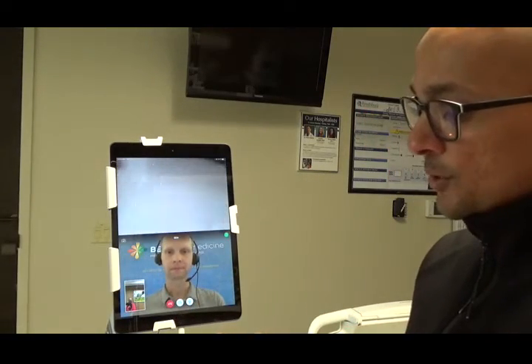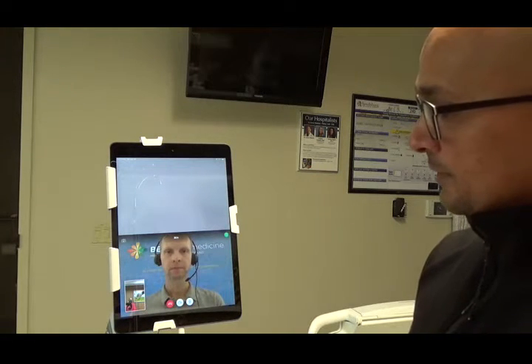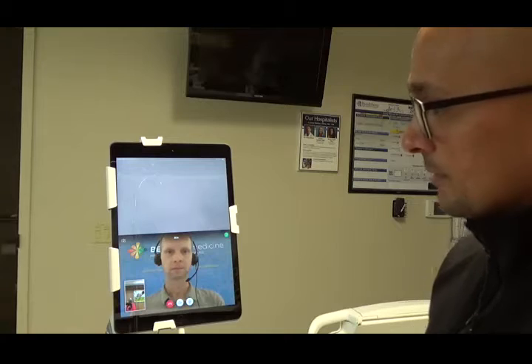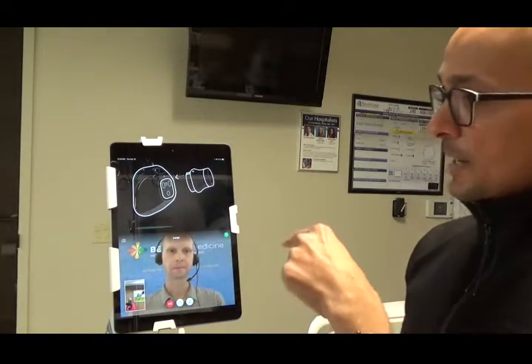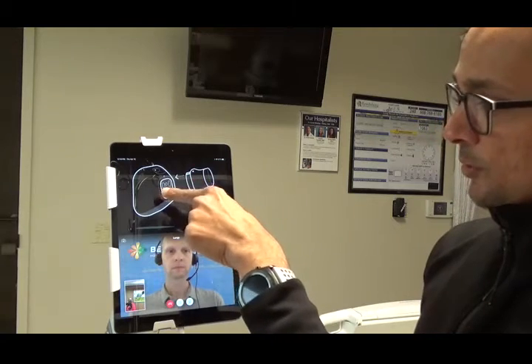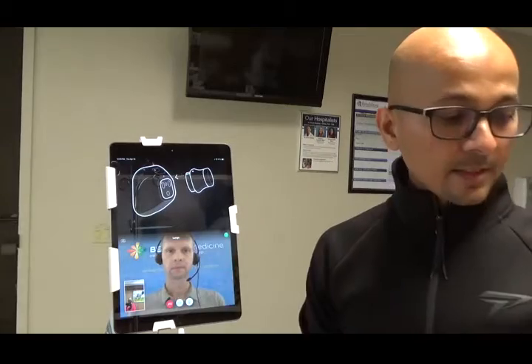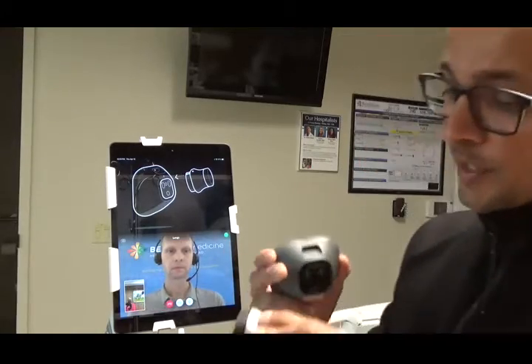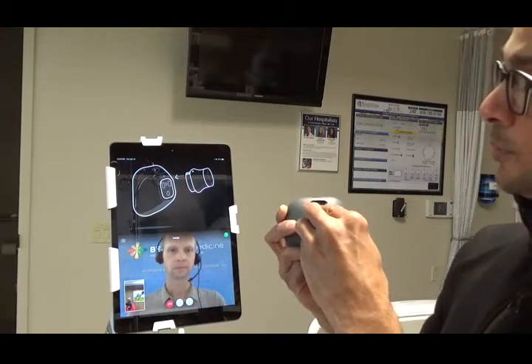So now what we could do is move forward to the auscultation part. Do lungs next. So we're going to do lungs, and it's really intuitive. It's going to tell you what to do, right? Which is saying this is a device, and this is the stethoscope attachment. There's a blue dot on here. There's a blue dot up here. Blue and blue go together.